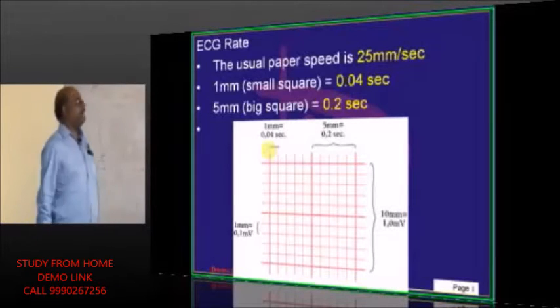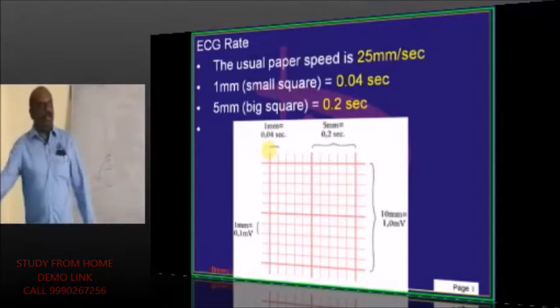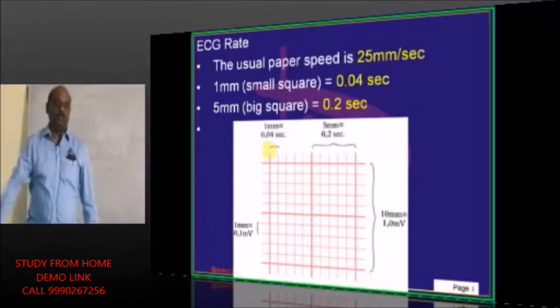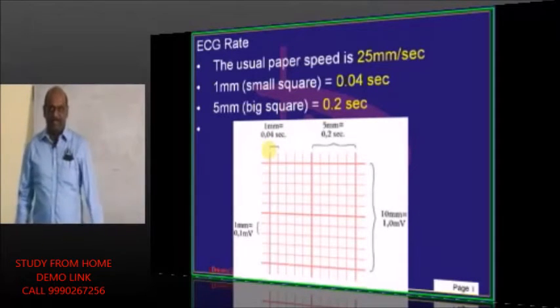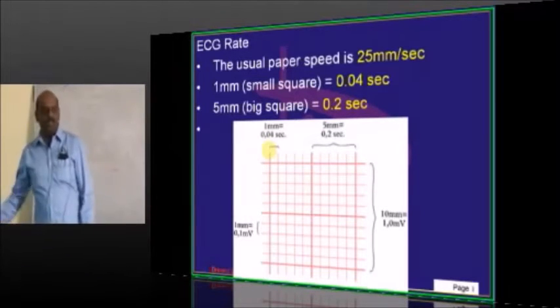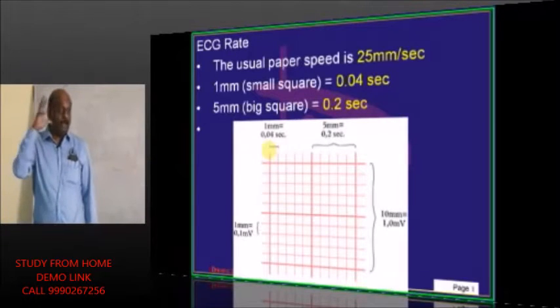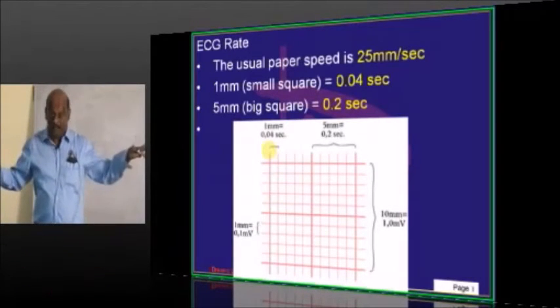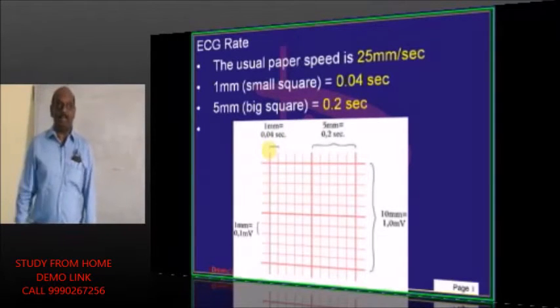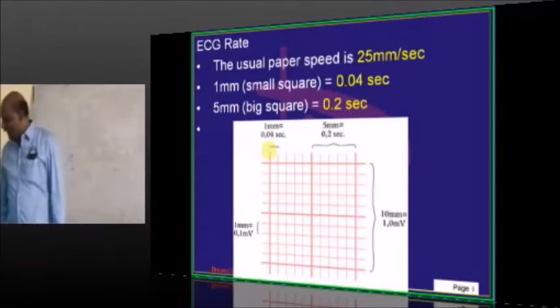First thing in ECG, doctor, the rate. Heart rate, how will you calculate? If you know your right hand is on right side, left hand is on left side, earth is below you, sky is above you, you know ECG. Because there is an aVF, there is an aVL, there is an aVR. So it's only right, left and bottom. Your parietal lobe, which gives spatial configuration, if it is still working, you know ECG. And if you say ECG, I did not understand, problem is with parietal dysfunction. So parietal lobe dysfunction. Okay?